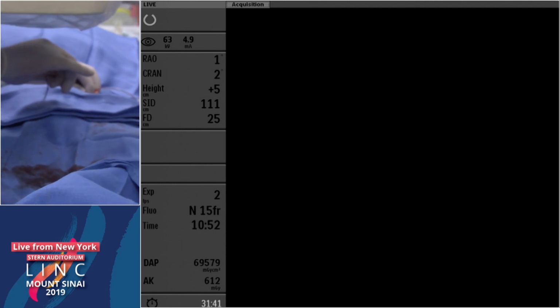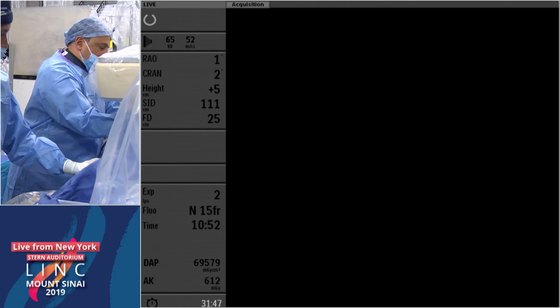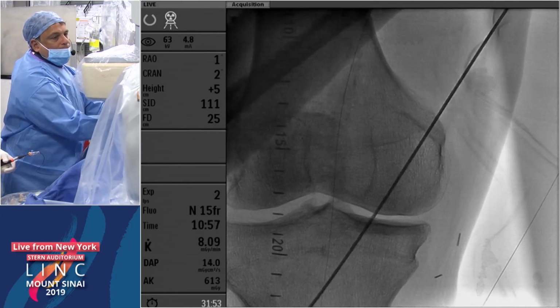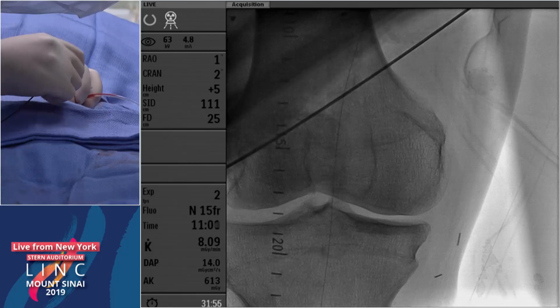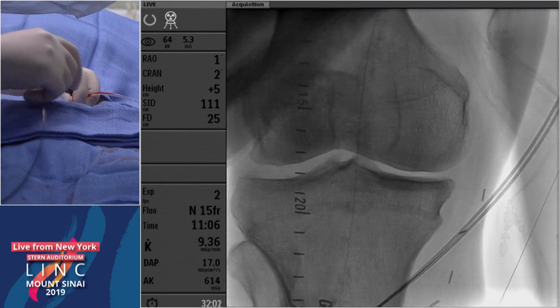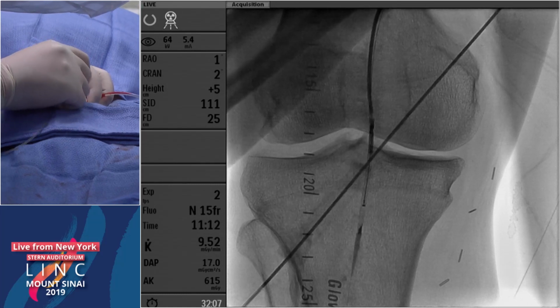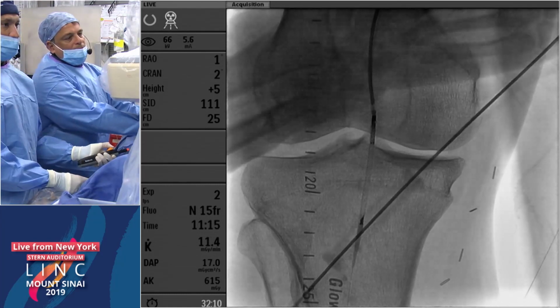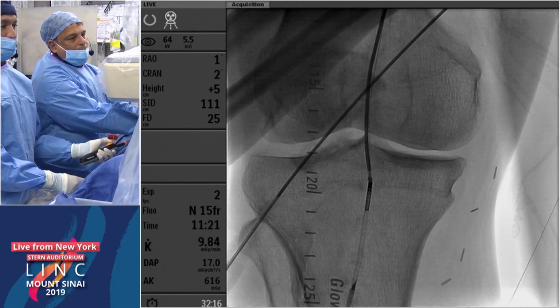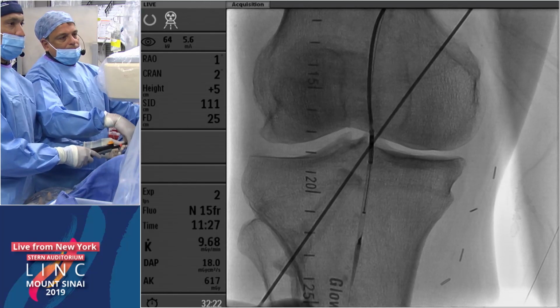Well, I mean, PK, coming to the topic of which target vessel to hit, I think we really have to have an idea of how big the wound is. If it's going to be a big wound on the heel, and it doesn't look like, even if you open the posterior tibial, it's going to stay open for too long, my bet would probably be to optimize the inflow and to have a good, durable result in the SFA and the peroneal artery, maybe with some drug-eluting devices, and basically give the leg some time to heal up without a re-intervention. So in these cases, I'll be more inclined to maybe use stents because, after all, it's a heel gangrene. If a heel wound doesn't heal, he gets an amp. So probably I'll be more inclined to use stents in the CLI.